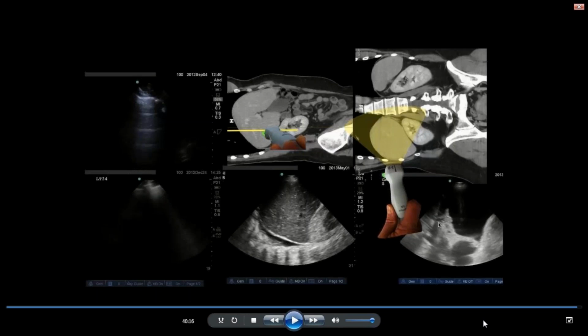Thank you, Dr. Bhagra. A related question from the same audience member is, can you differentiate fibrous tumor, benign versus malignant mesothelioma? It turns out that fibrosis will often have a fairly classic appearance: multiple B-lines and a thickened pleural line. There are variations on this as well.